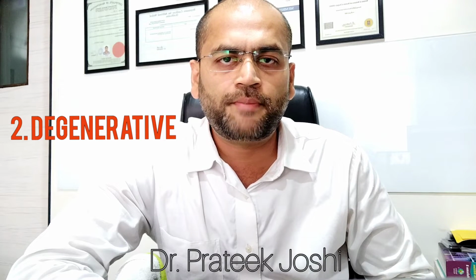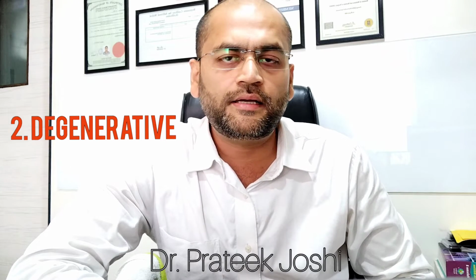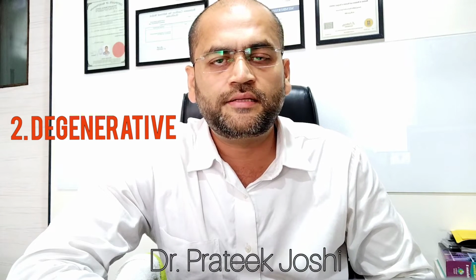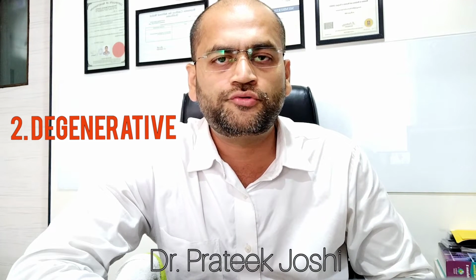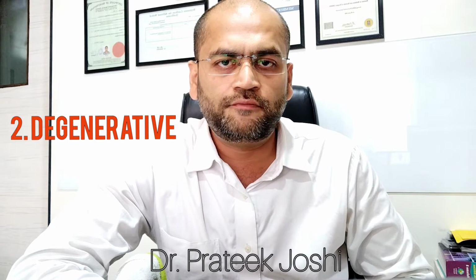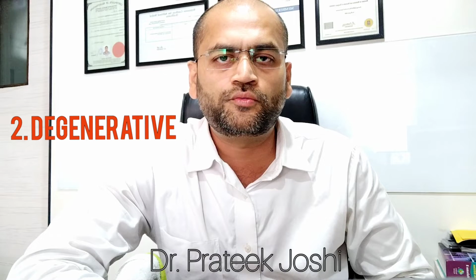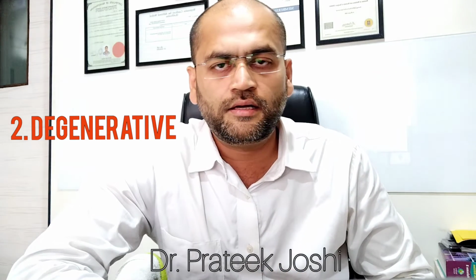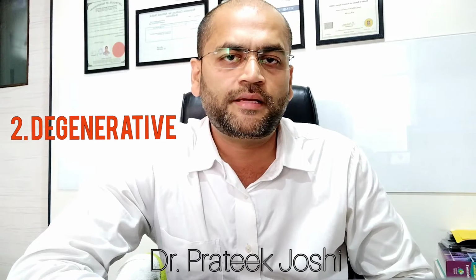they also can be repaired, provided mechanical malalignment also have been addressed in such individuals, because we usually see varus deformities in the knee associated with medial meniscus tears or root tears. So we need to address both mechanical deformities as well as the meniscus tear. So let's start with the surgical video of arthroscopic meniscus repair.